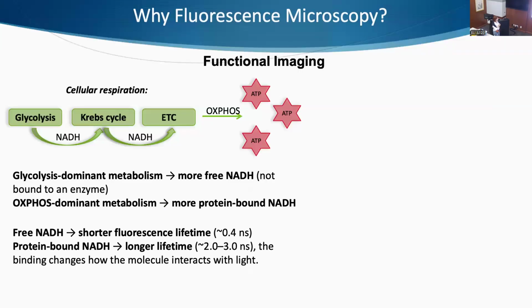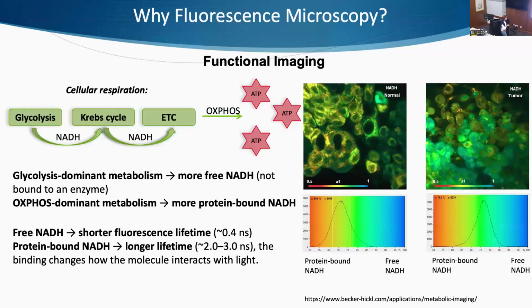This free NADH that's not bound to an enzyme has a much shorter fluorescence lifetime with respect to the protein bound NADH. And this is what researchers use to look at the metabolic changes in cancer versus normal cells.